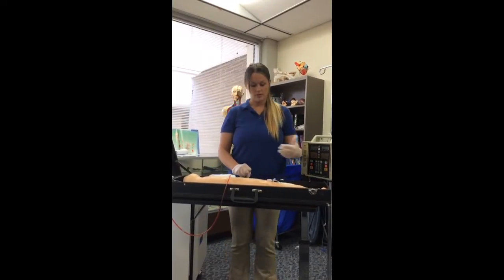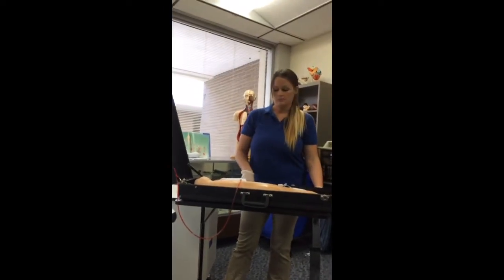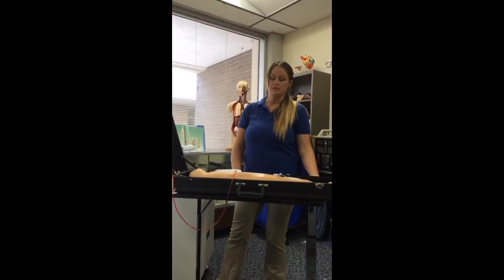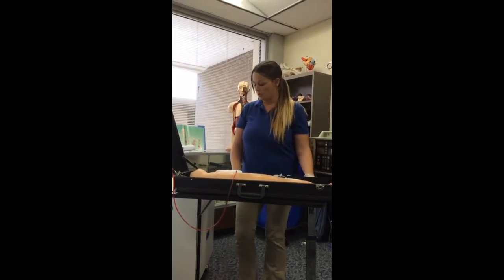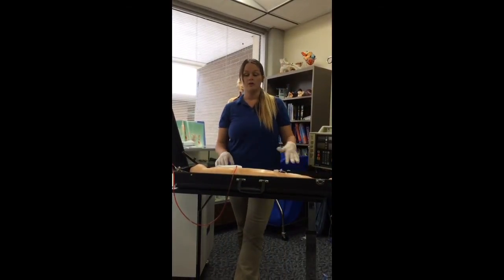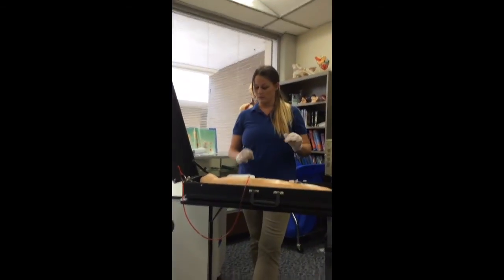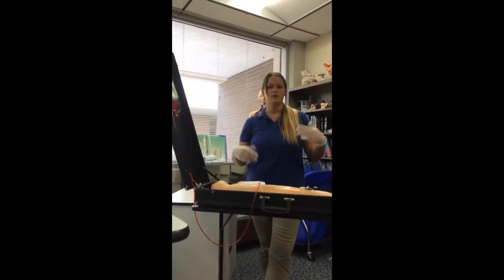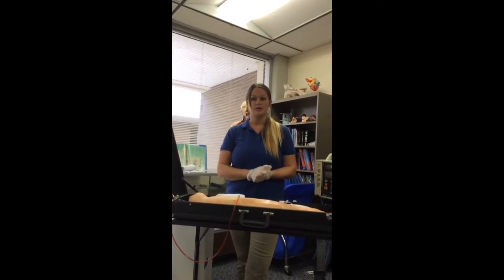I'm going to ask the patient if he's comfortable on the 4 Ps once again. I'm going to tell him where the call light button is, and then I'm going to document using the MAR: time, drug, route, condition of IV site, volume of fluid used. And that's about it.